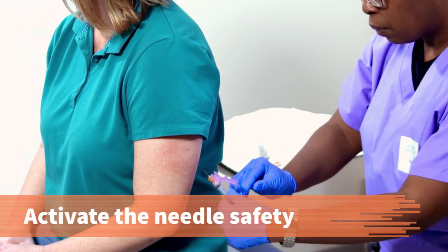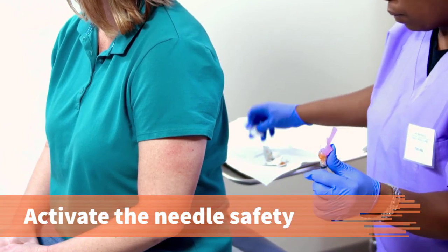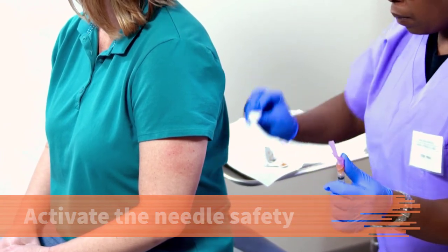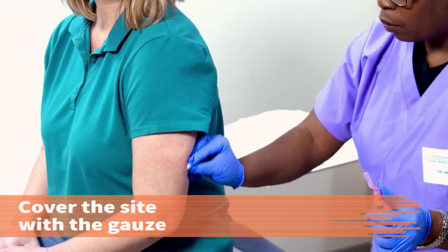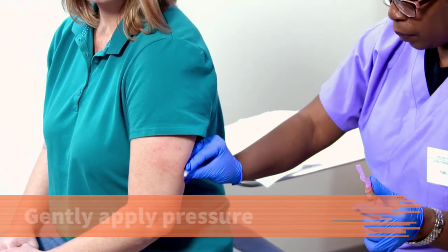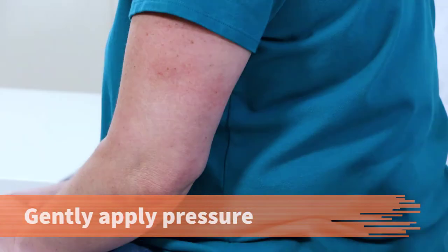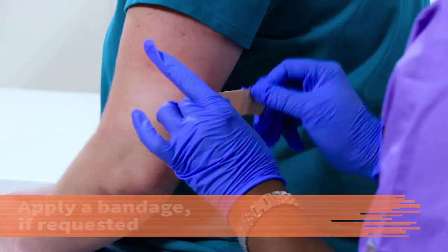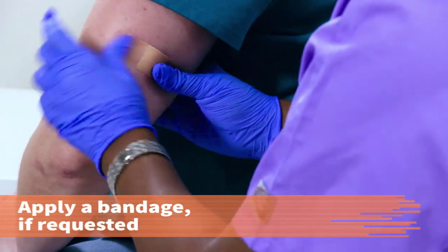Activate the needle safety device with one hand while the other hand covers the site with gauze or a cotton ball. Gently apply pressure at the site to stop any bleeding. Apply a bandage if the patient requests it.